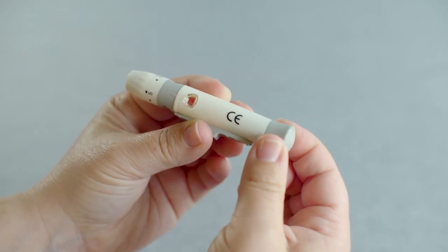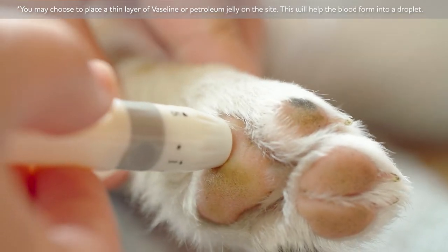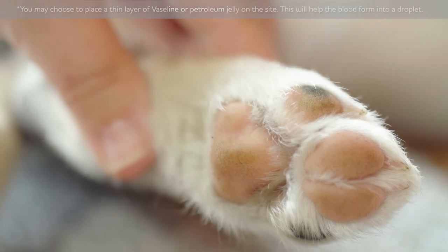Pull the barrel back until you hear a click. Place the lancing device softly against your pet's skin, and press the clear trigger button to release the lancet.